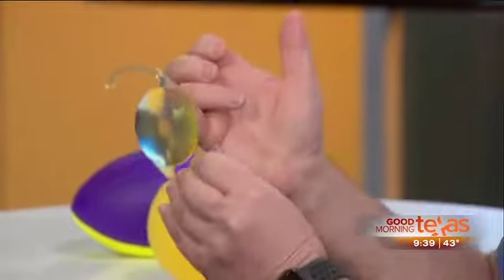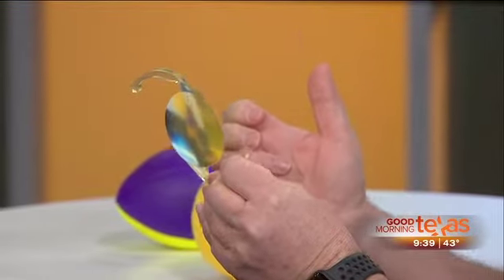What about people who have cataracts and astigmatism? That's a very good question, because many cataract patients also have astigmatism. What we have now are what we call toric lenses. Here's a very enlarged lens. Obviously, this is not what we'd use in the eye. They're microscopic. But it has an area of curvature to correct astigmatism built right into the lens implant, so at the same time we do cataract surgery, the lens implant takes care of the astigmatism and the vision. In fact, these toric lenses can be combined with our high-technology lenses like Symphony and Crystalens, so we can get more perfect vision at distance, intermediate and close up, all distances.